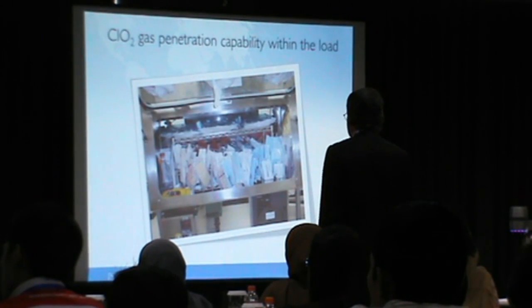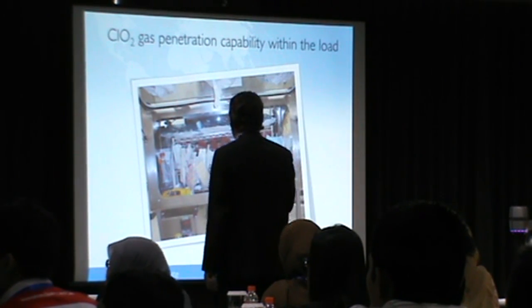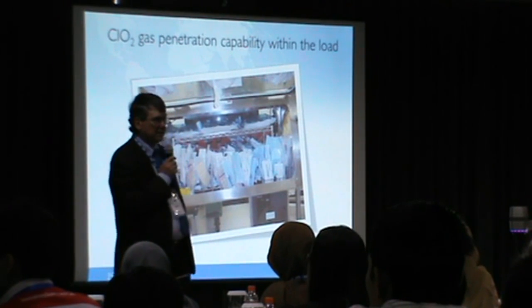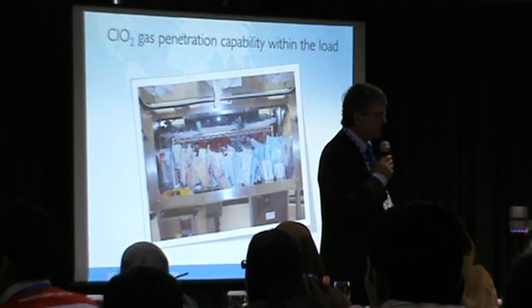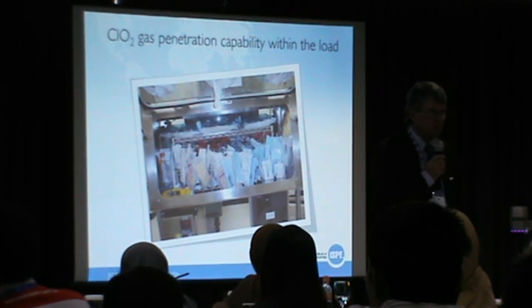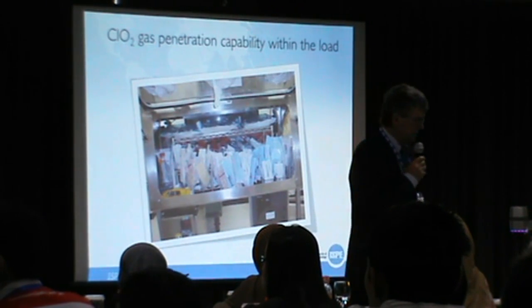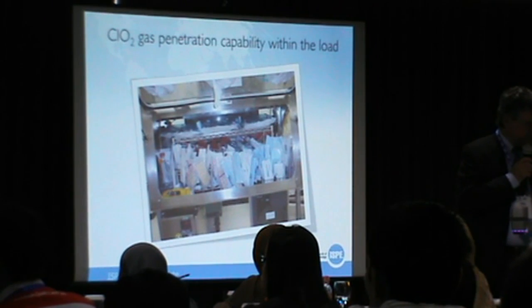The chlorine dioxide is capable of penetrating a load pattern like this, very stacked, while with the other systems you need to give some space in between to let the biocide penetrate much better into the load.